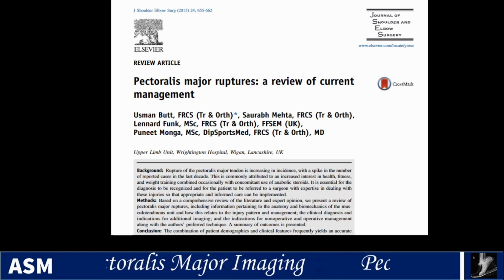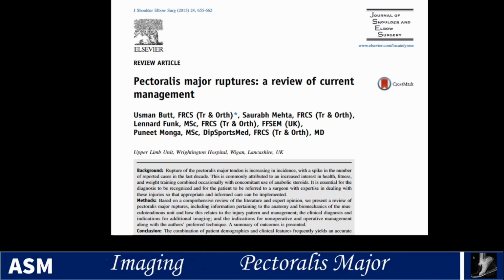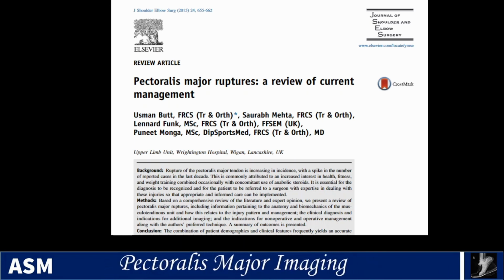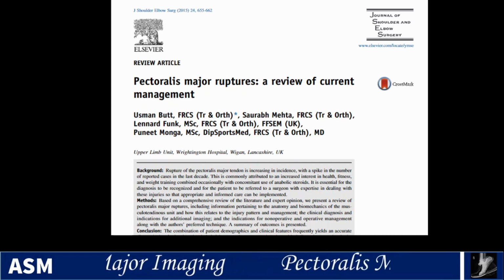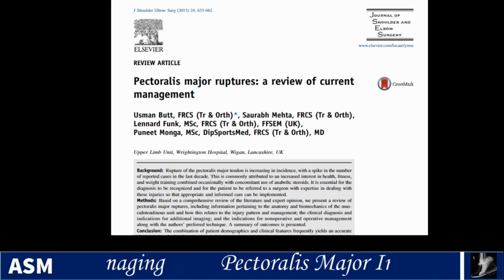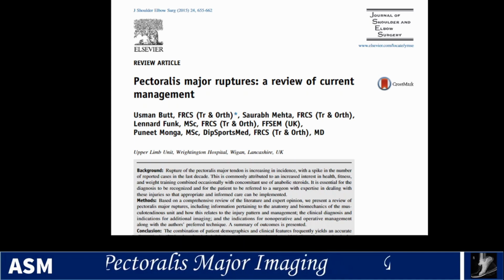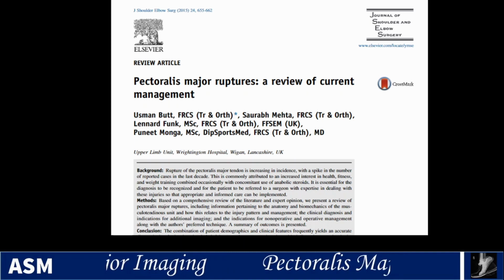The surgical treatment for this is typically going to involve placement of suture anchors in the humerus at the native attachment of the pectoralis major, and then suturing the tendon back down, or in the case of tendon that's not of good quality, you may see allograft augmentation to augment the strength of this repair back into the humerus.